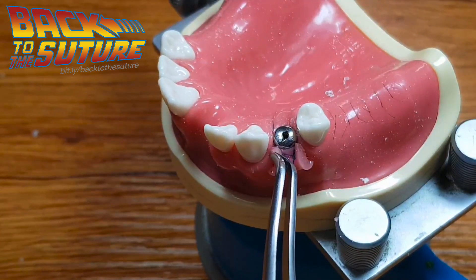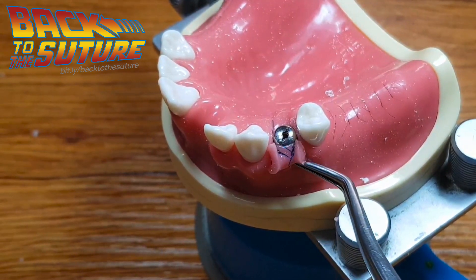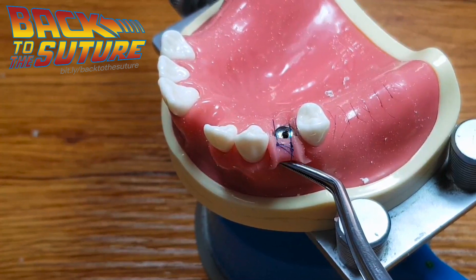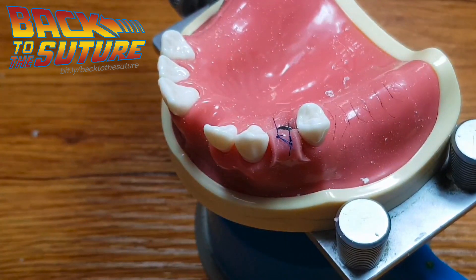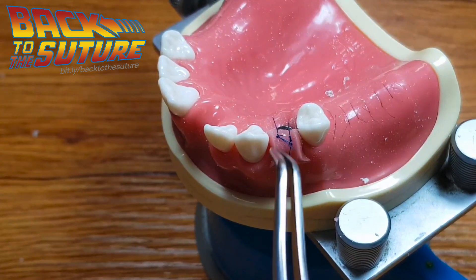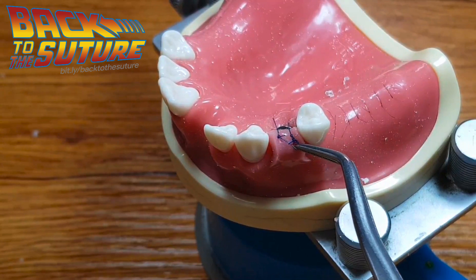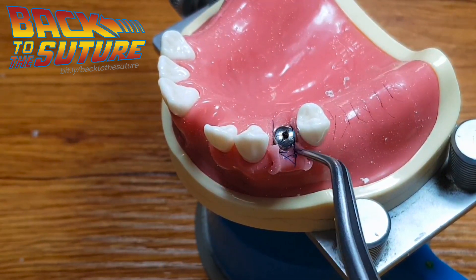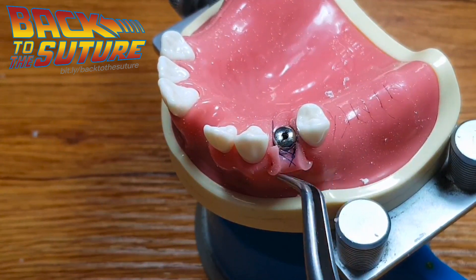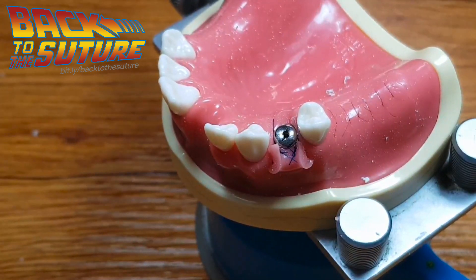It is very difficult. It may look okay now, but after a couple of hours this soft tissue will climb up, and your patient will come back like this after 10 or 14 days. So you lose the volume on the buccal aspect, you lose keratinized tissue due to necrosis, and the healing will not be ideal. So how can we prevent the soft tissue from climbing up the healing abutments? I am going to recommend the flap folding suture.